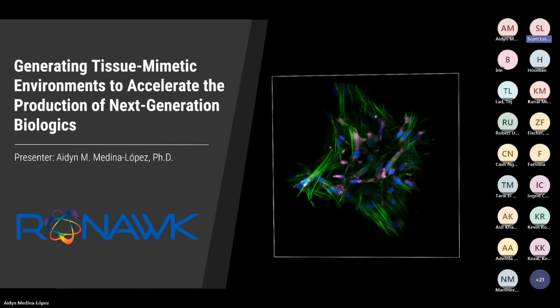So, Aidyn, I'd like to clarify two things on that. So this means you don't trypsinize the cells to do a passage, correct? Correct. And the second is something you didn't mention: how long have we been able to keep cultures going by just adding and subtracting blocks? Oh, yes, we have done a continuous culture for up to 6 months.